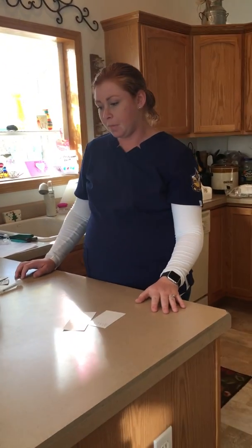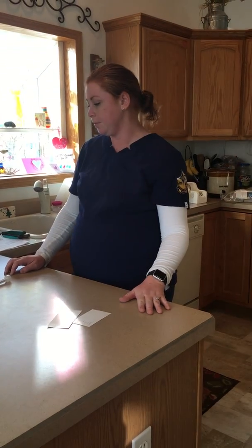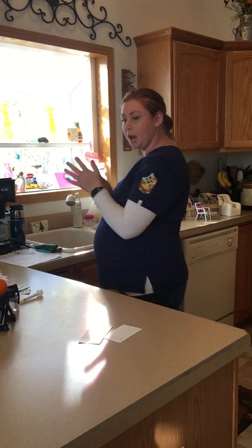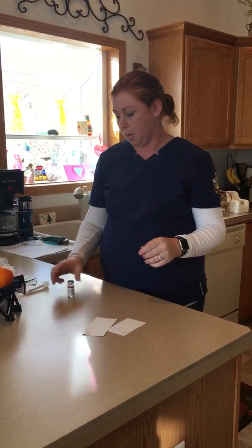For this particular test, I'm going to start by washing my hands really good. Then I can go ahead and prepare my medication after I check doctor's orders and the patient's MAR. While I'm there, I'll double check for allergies.